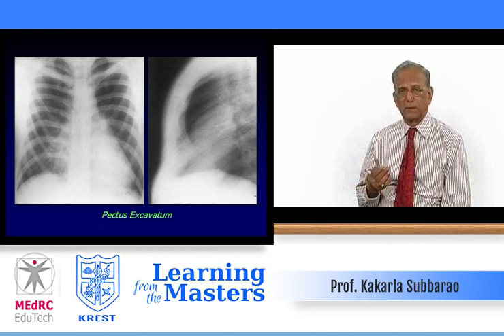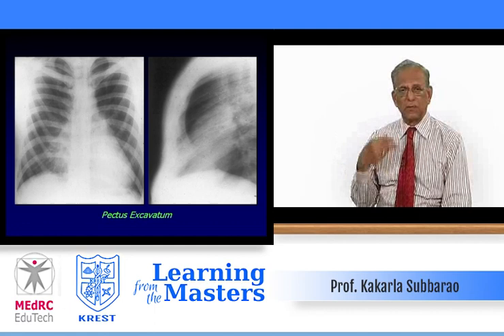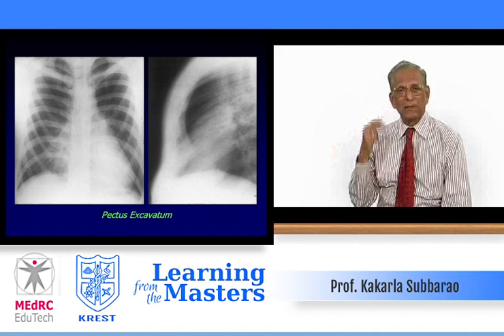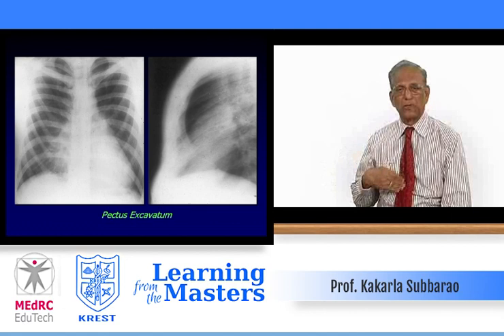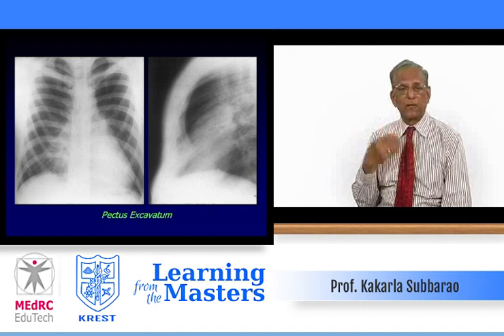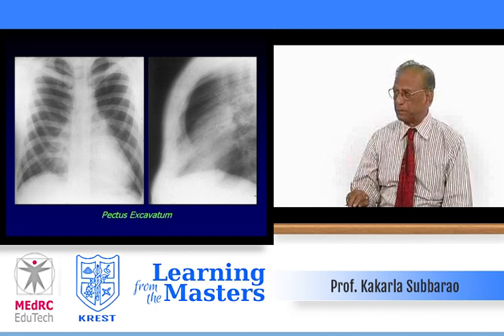A common scenario in pediatric practice: a child presents with some symptoms, you take a chest film, the cardiac size looks enlarged, and the right cardiac border is not seen. You should immediately think of pectus excavatum. Look at the lateral view — the excavated portion of the lower end of the sternum pushes the heart to the left side where it looks enlarged, though it is not really enlarged. Occasionally you may find a benign murmur, but it is still pectus excavatum.